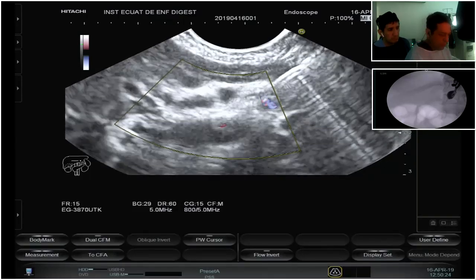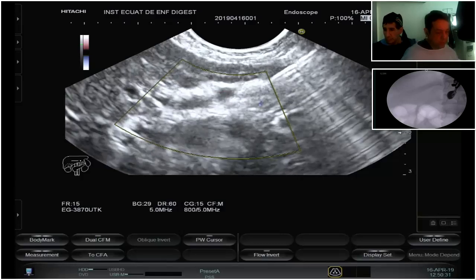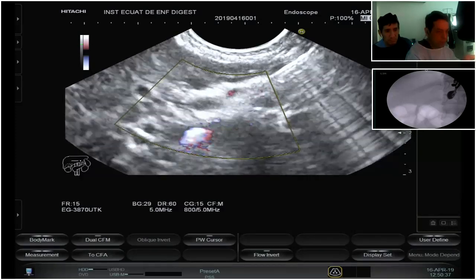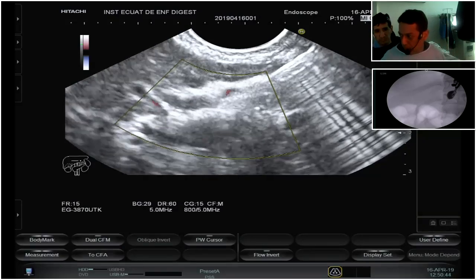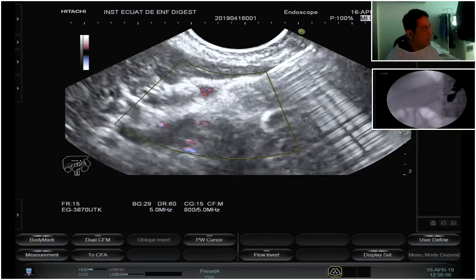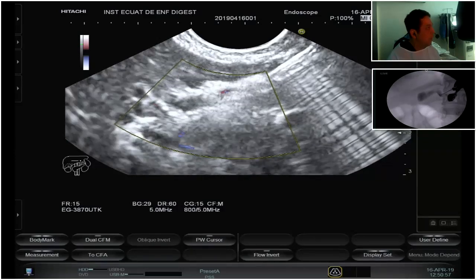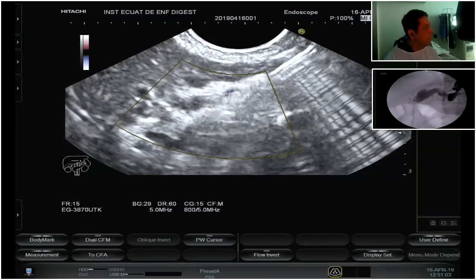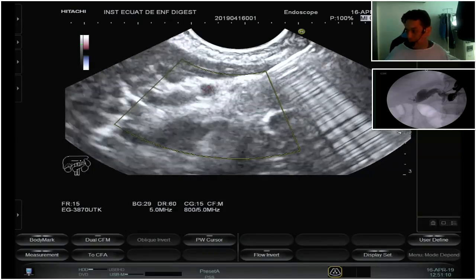Give me, I think we are. Okay, I will see that. Give me saline solution first. Zero contrast. Yes. Yes, we are. We're inside. Give me more contrast. Can we see the fluoroscopy, please. So we're inside, huh?